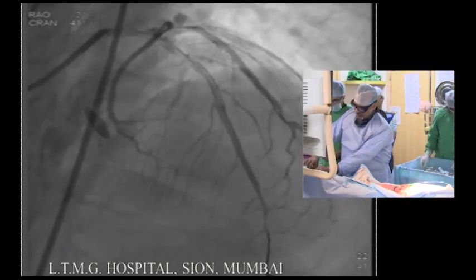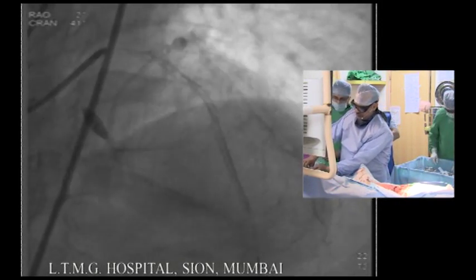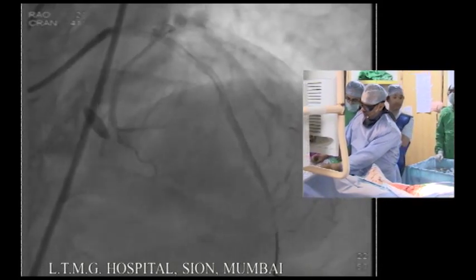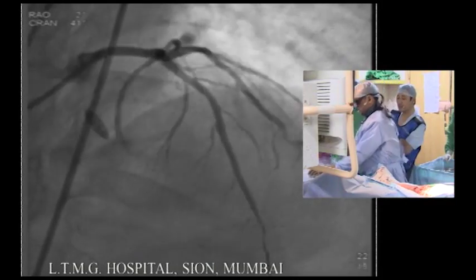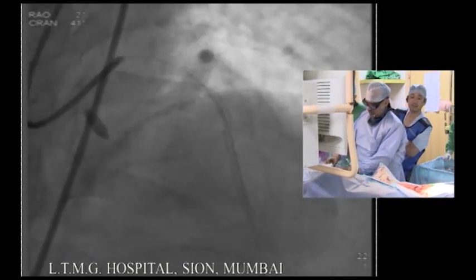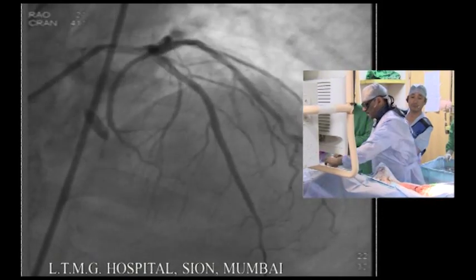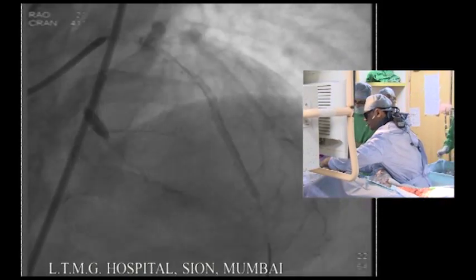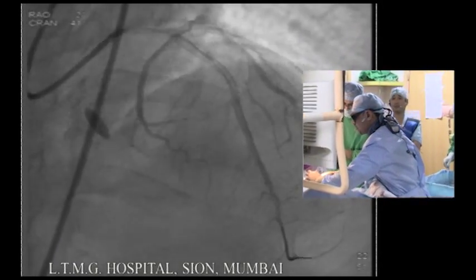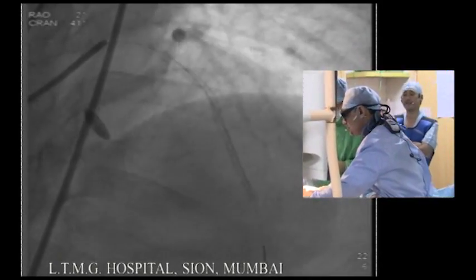Would Dr. Hamazaki say that he would have approached this differently? Dr. Hamazaki, how would you have approached? How would you do this PCI? Would you have done the same way or different? There is no difference until now.